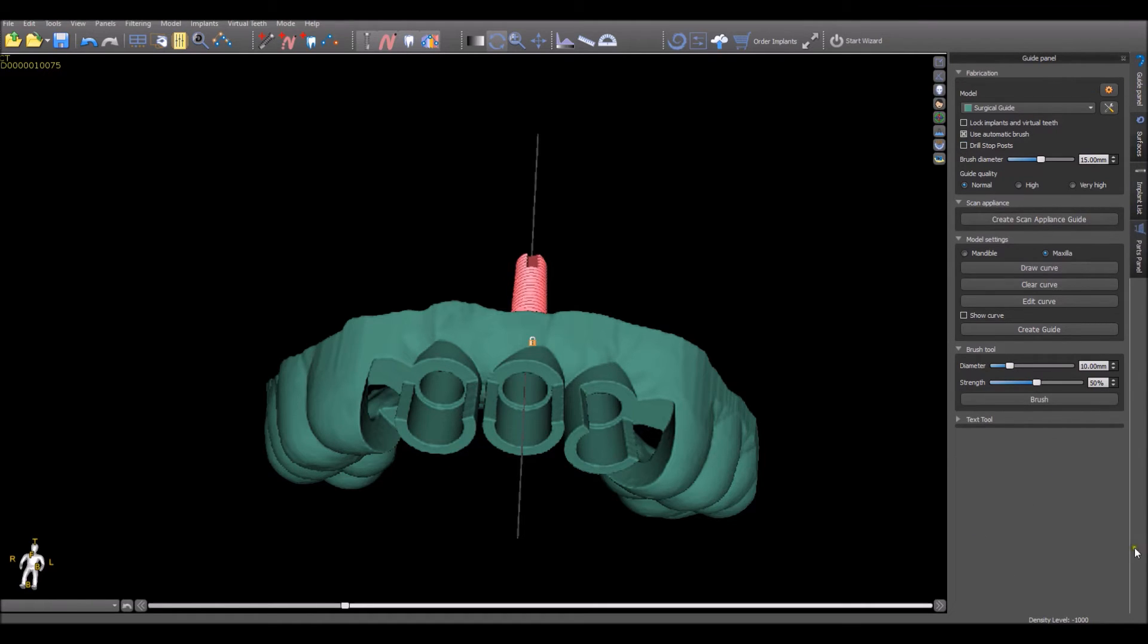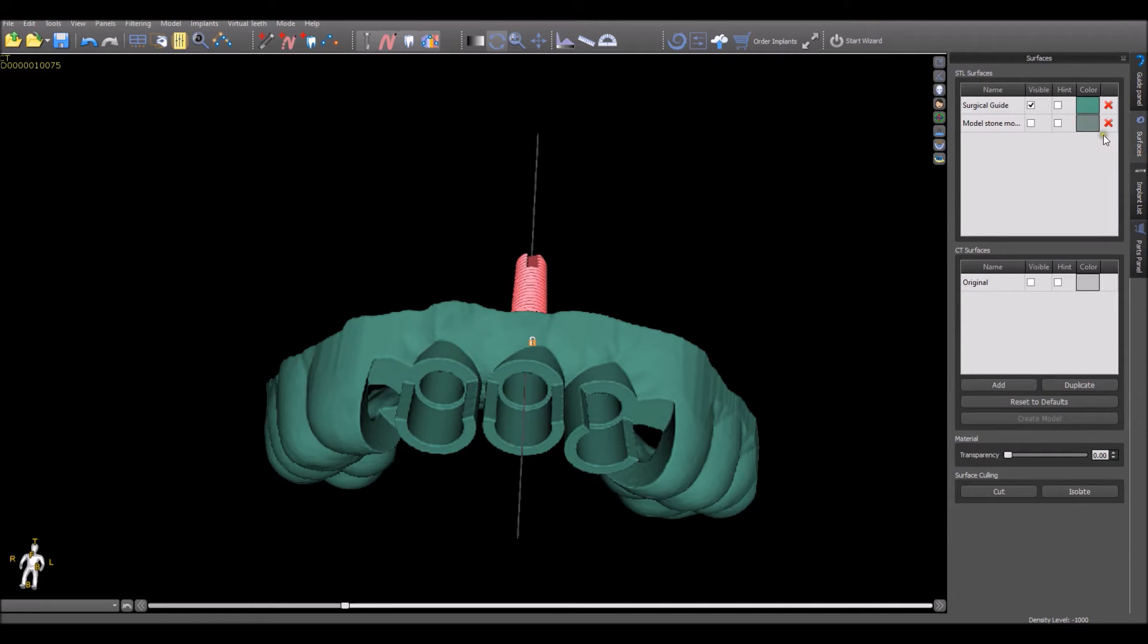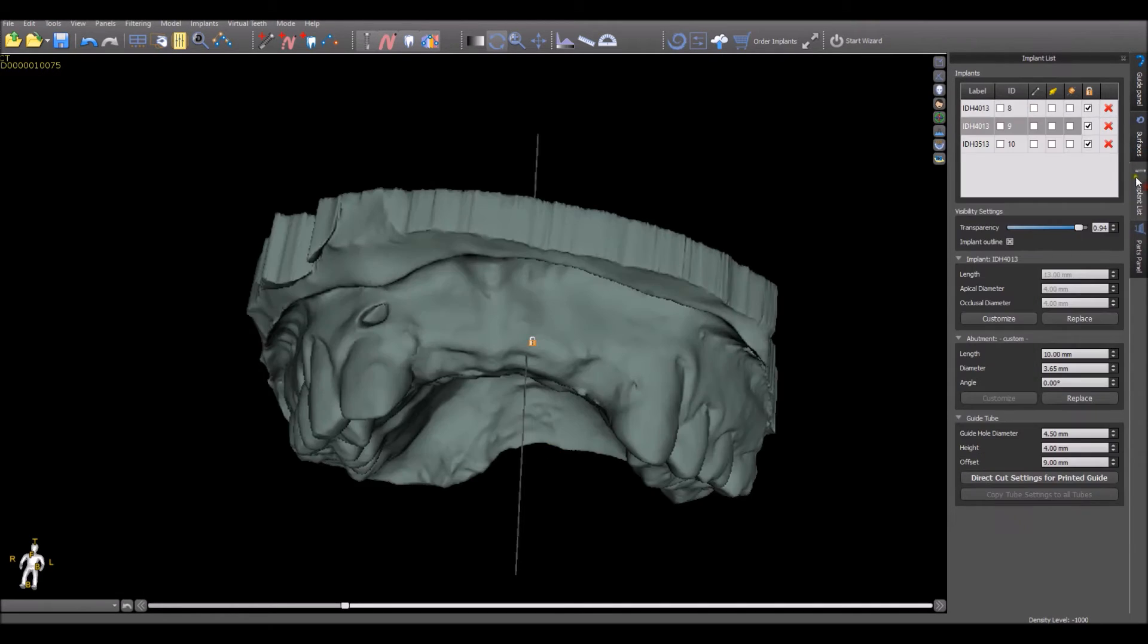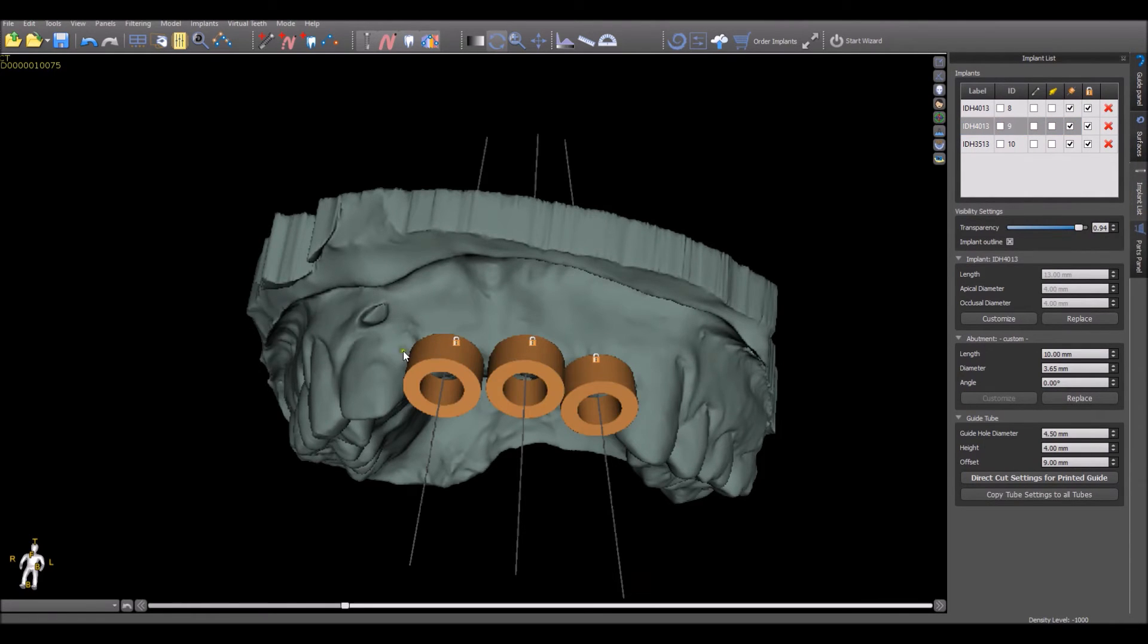We can see the bottom section for the drill stops have disappeared, and they have disappeared from the software guide tubes as well.